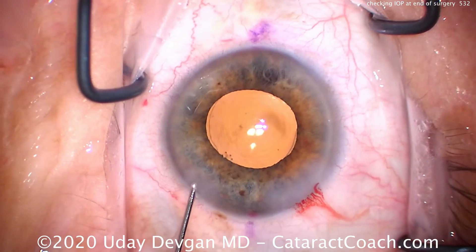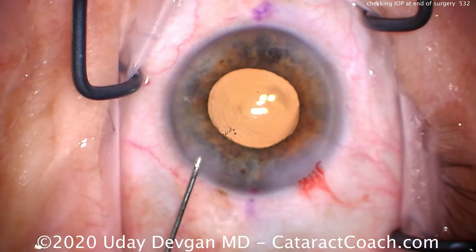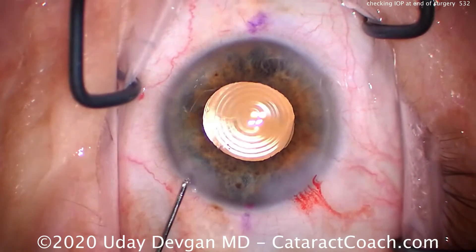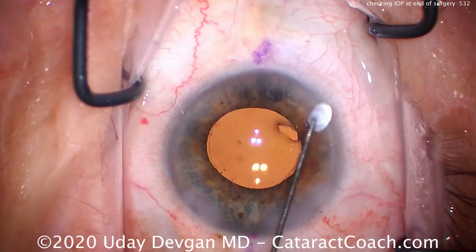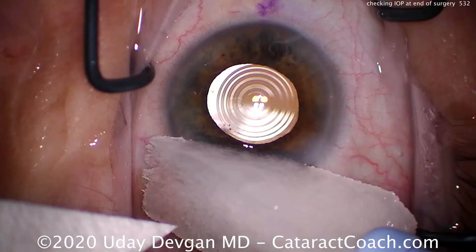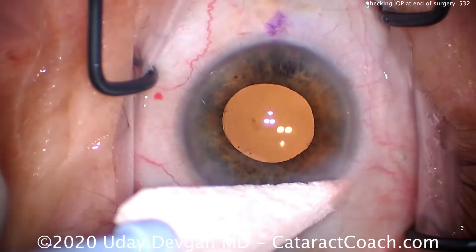Let's look at one more case. This is a toric trifocal lens — you can see the toric marks on the lens. The phaco incision is 90 degrees away from the steep axis, from the orientation of those toric lens marks. We filled up the eye; the pressure looks pretty reasonable. We're going to look at our incisions. Here's a Wexel sponge soaked in tetracaine — I'll place that over the incision and then use another sponge to check.